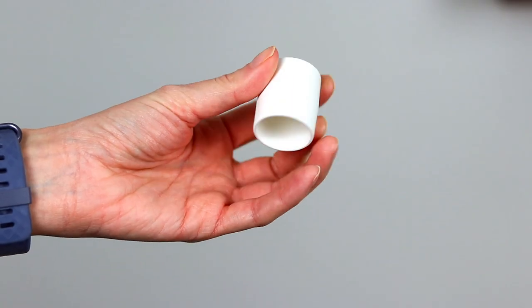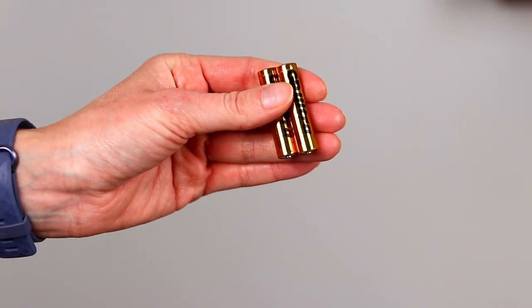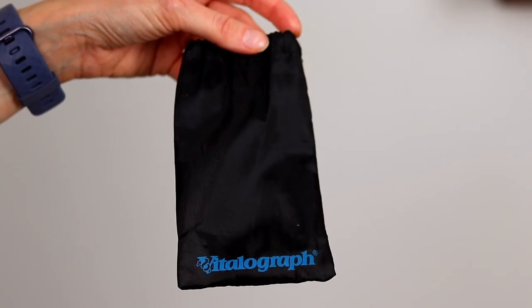When you open the box you should find a spirometer, a removable mouthpiece, a nose clip, some batteries, and a handy little bag to keep it in.